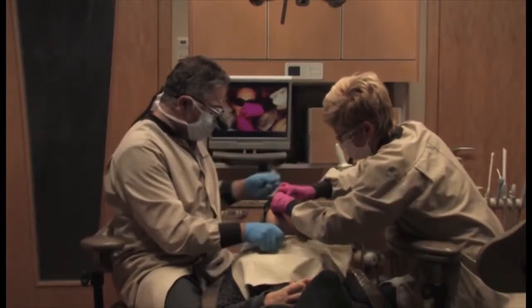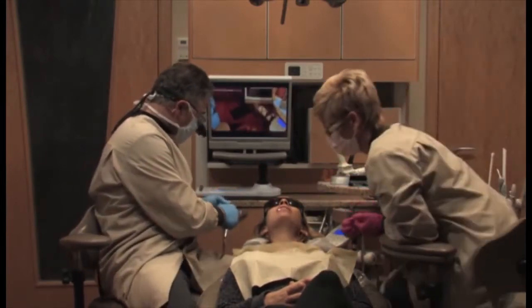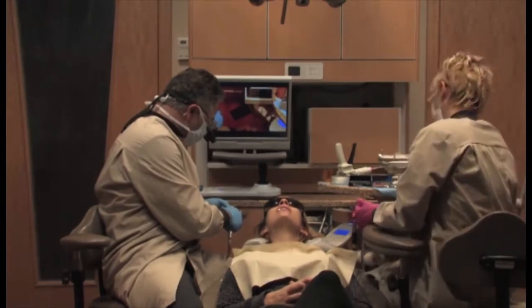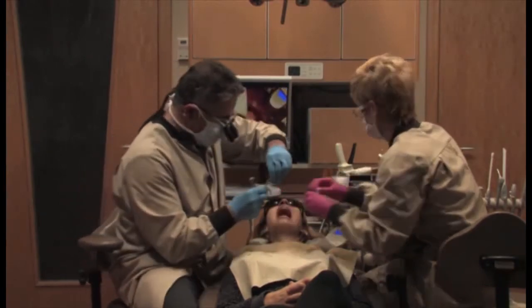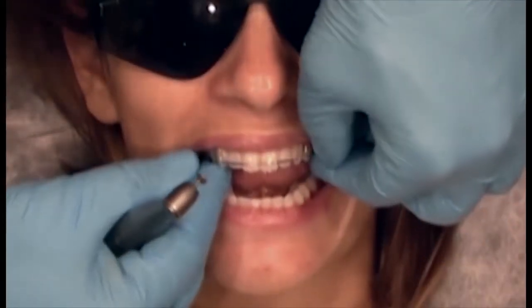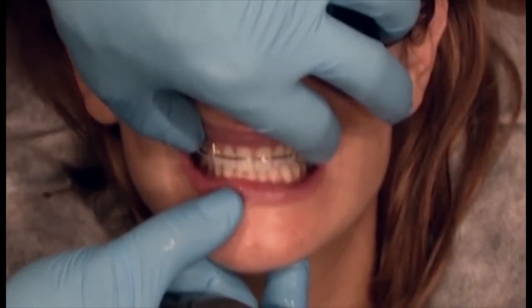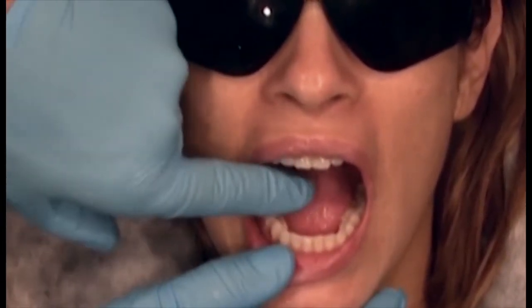Whenever we take the deprogrammer out, it's critical that the patient does not touch their teeth together. If they try to articulate on their teeth, they'll bring back the memory pattern of their own occlusion, and that's not what we want. Just very gently tap up and down. Do you feel any posterior teeth starting to come? Where is your initial point of contact? On the right side.